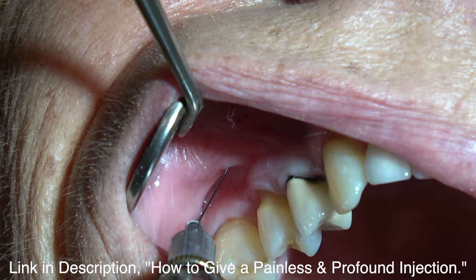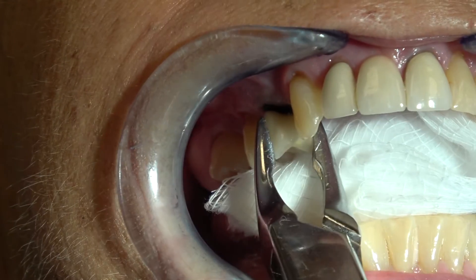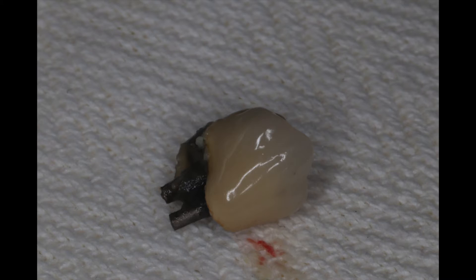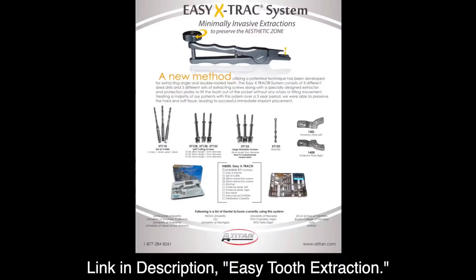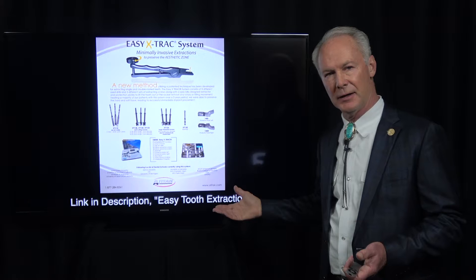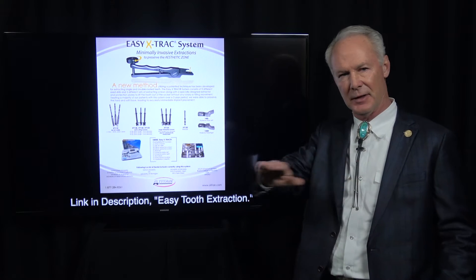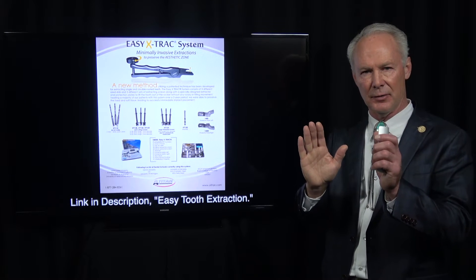Local anesthesia. I'm not removing the entire tooth — only the coronal part will be extracted because of the horizontal fracture. We're going to use the Easy Extract extraction system. I couldn't practice without this. When a cuspid tooth is fractured at the gum line, it's practically impossible to remove that root unless you remove a lot of facial bone, and if you're placing an implant, you want to preserve the bone around the tooth.